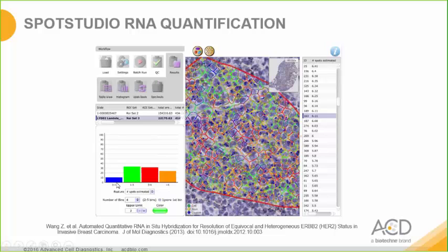In the panel to the right, you can see each cell is assigned a unique ID number with the number of dots it contains. In the panel above the histogram, you can see that some other information is generated for this region of interest, which includes total area analyzed and total cell count.